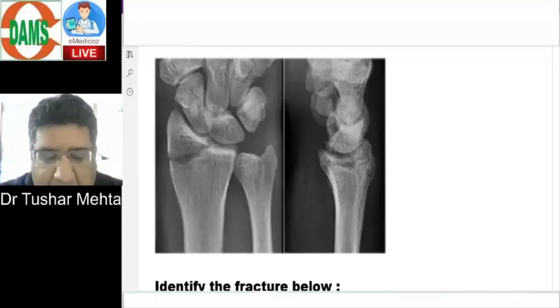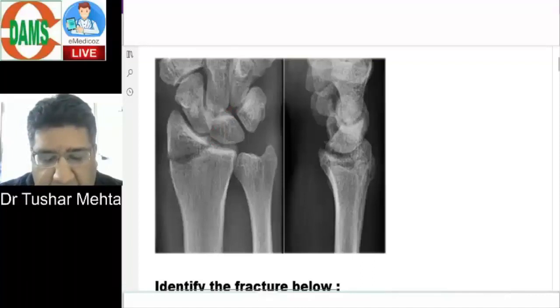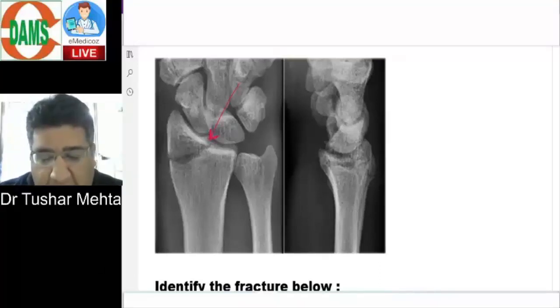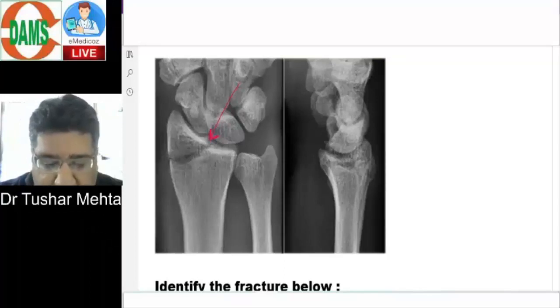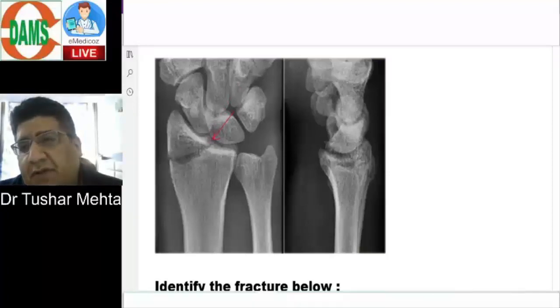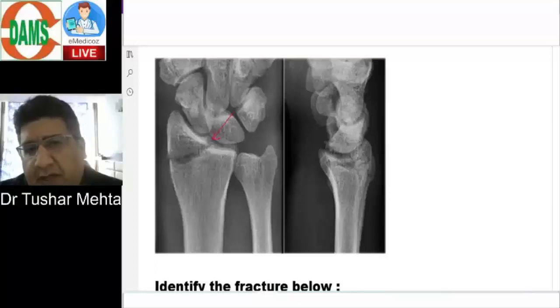What I'm trying to tell you is that you have to see whether this fracture of the distal end of the radius is extending into the joint line or not. This fracture line is actually not only extending but communicating with the distal radial articular surface — there is a small breach there. So if this is a fracture of the distal end of the radius extending into the distal radial articular surface, we will call it an intra-articular fracture of the distal end of the radius.